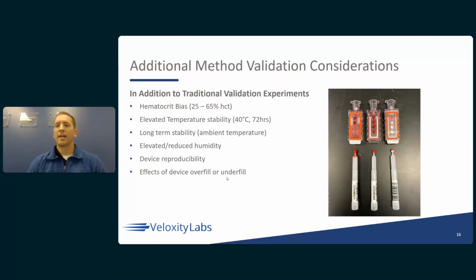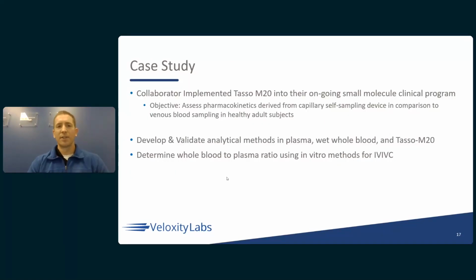And so just kind of assessing, you may have a situation where an underfill means you have 3 devices that are perfectly filled and then one empty one. You could do an assessment to see if the top device still meets acceptance criteria. Obviously with the Mitra, probably not as possible because there's only one cartridge, and you can see that's just going to have less blood volume. So incorporating those into your experiments and then figuring out when you see those in the sample analysis phase, how to deal with those.